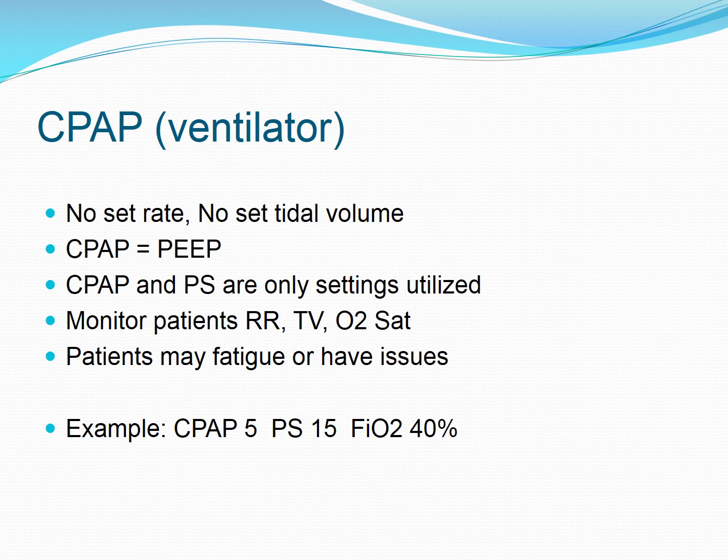So you can also do CPAP on a ventilator, and sometimes they will do what's called CPAP trials on patients. What we're trying to do with a CPAP trial is see how well this patient is doing so we can hopefully get them off the ventilator.